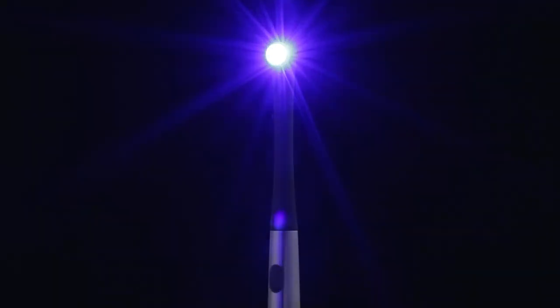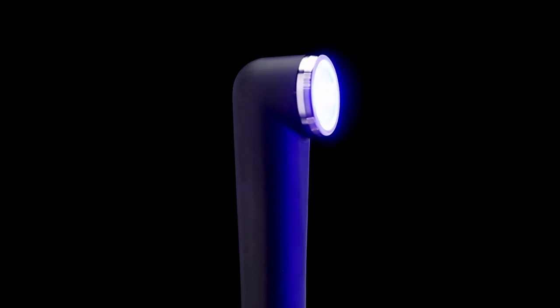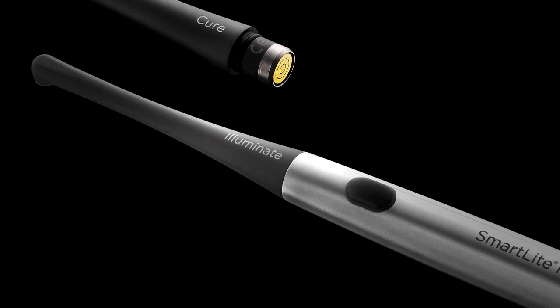One press of the button delivers a powerful 10-second beam that completely cures most Dentsply Sirona restoratives with no guesswork. The modular design of SmartLight Pro accepts additional tips that can be changed for different clinical indications.